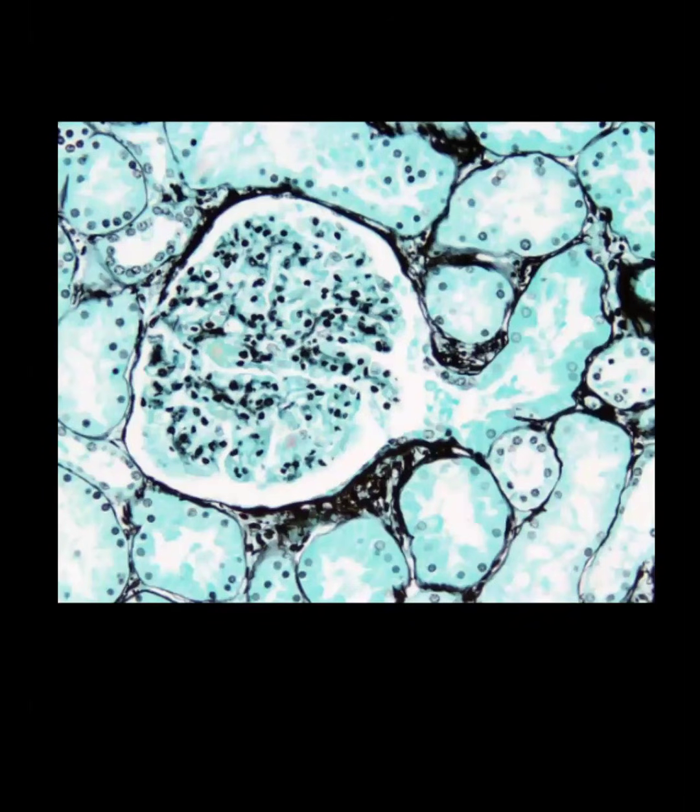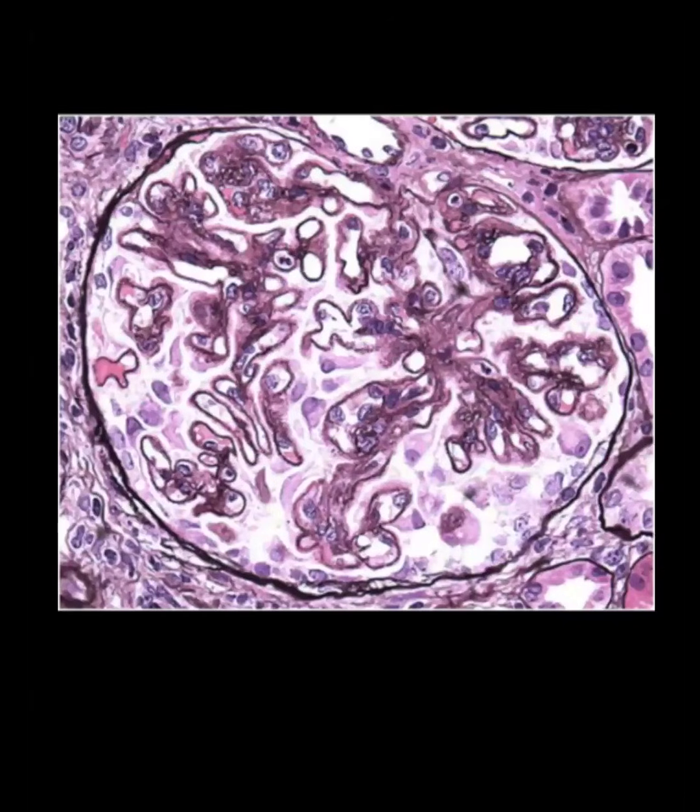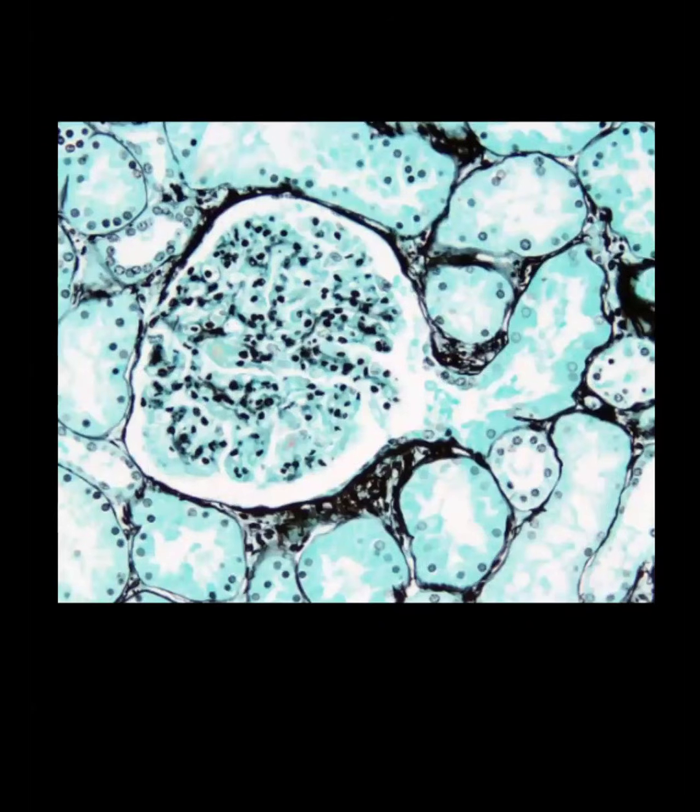Trichrome stain. Right. Yes, trichrome. This is the methenamine silver stain. In the silver stain, you can see that the GBM appear black.